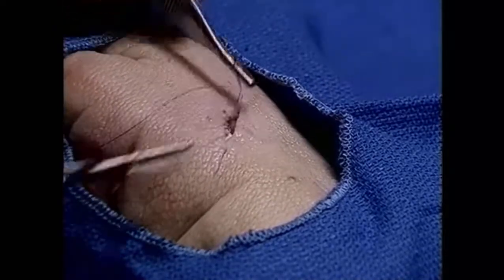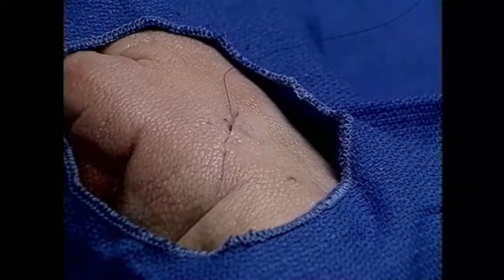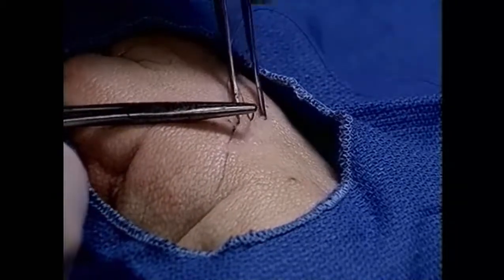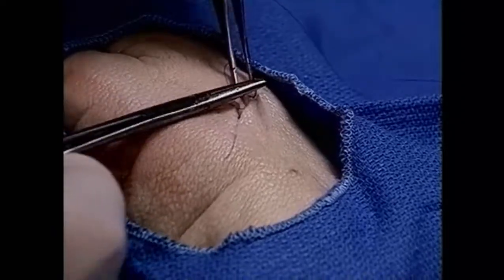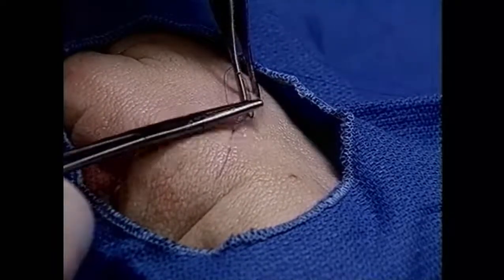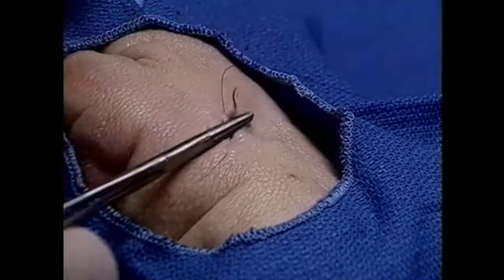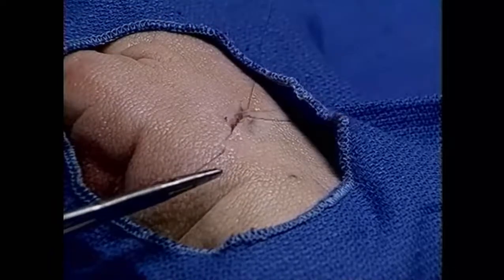Small little bites, making sure that you don't go through the loop with the suture material. This is somewhat more time-consuming than simple sutures, but the nice aspect is there is no cross-hatching possibility whatsoever, because there are no sutures crossing the wound.